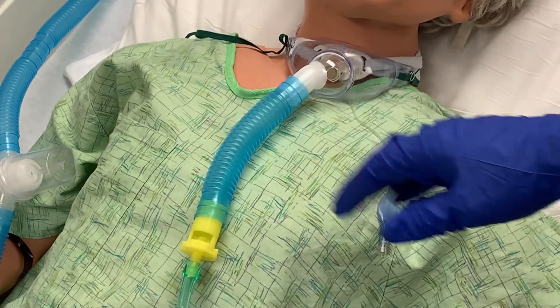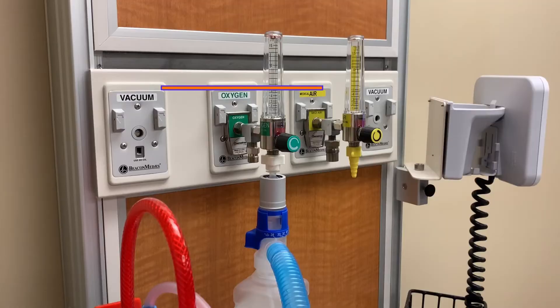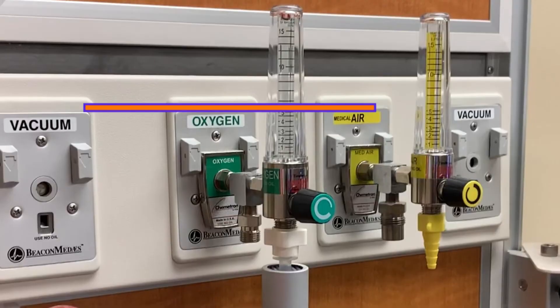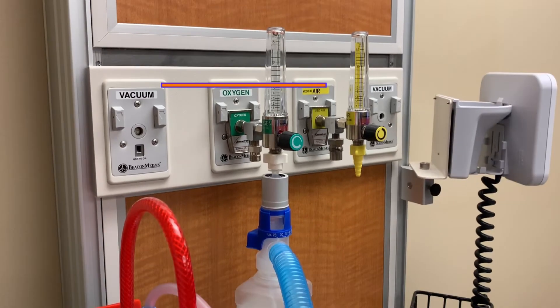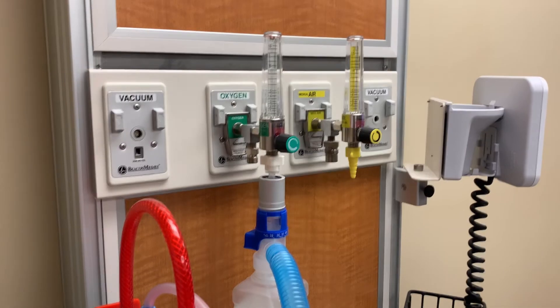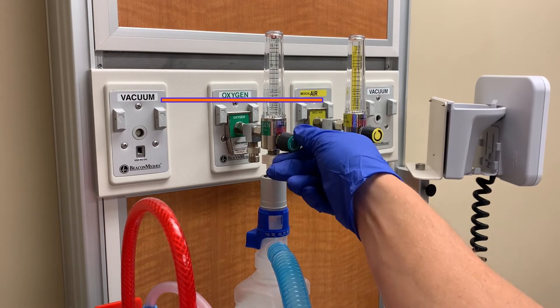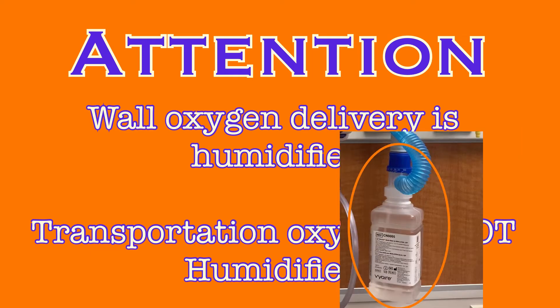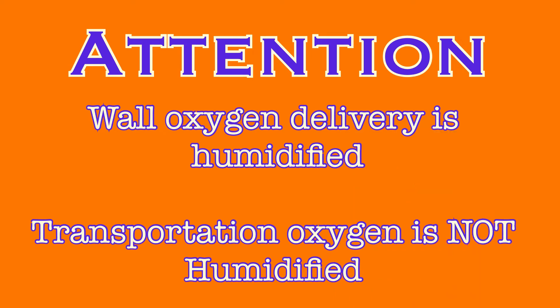Disconnect the blue tubing from the trach collar and attach the blue tubing from your venti mask kit. Your patient is now ready for transport. Make a note of the oxygen settings your patient was using — this patient was receiving 28% oxygen with 6 liters of oxygen flow. Turn off the oxygen flow from the wall unit. You will notice that the wall oxygen delivery is always humidified with sterile water, but the transport setup does not include humidification. This is normal; we do not humidify oxygen during transportation with these patients.